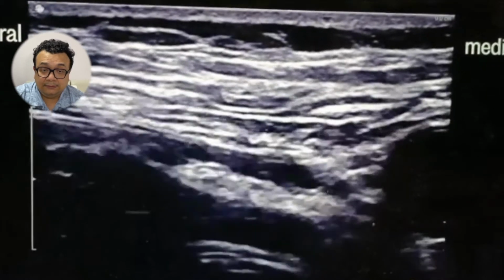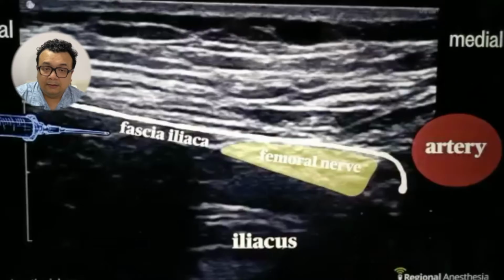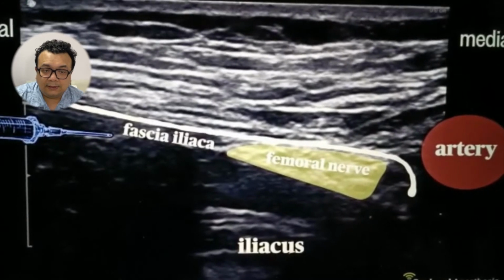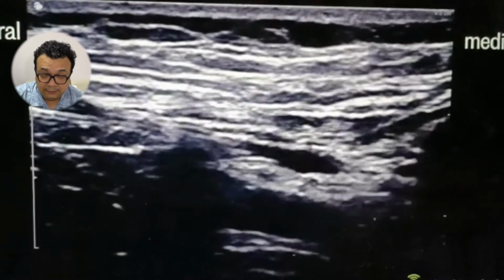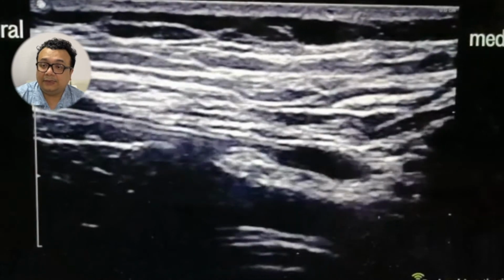But you have to remember this one is only used for analgesia because the local anesthetic is only deployed at the upper part. If you want to use it for anesthesia, you must deploy local anesthetic below as well. Okay, we run back the movie. This only deploys the upper part. You can withdraw the needle and deploy on the below side to get better coverage.